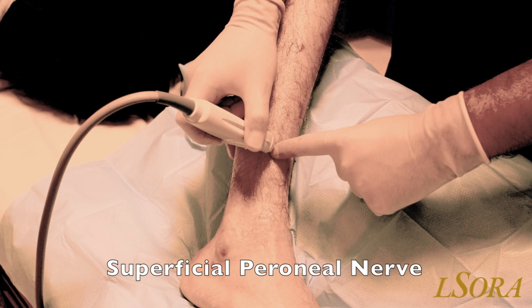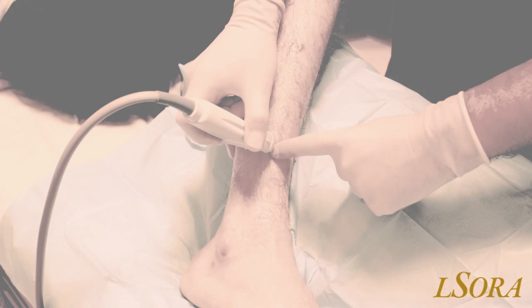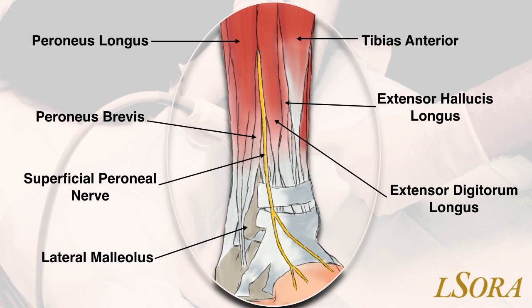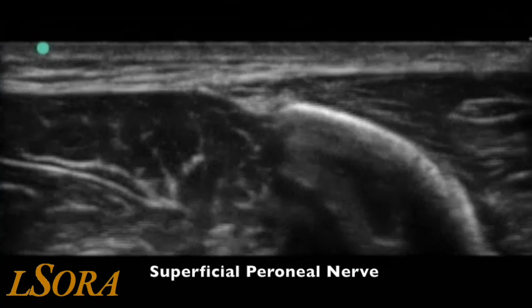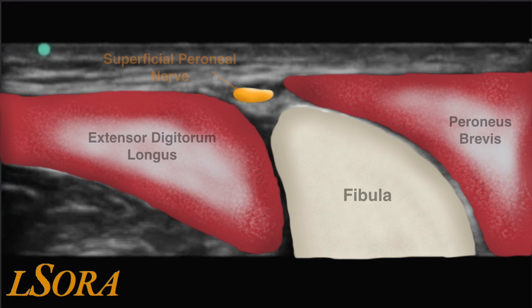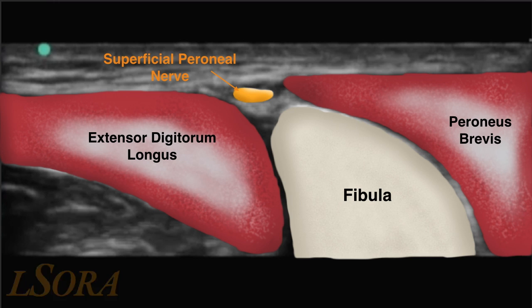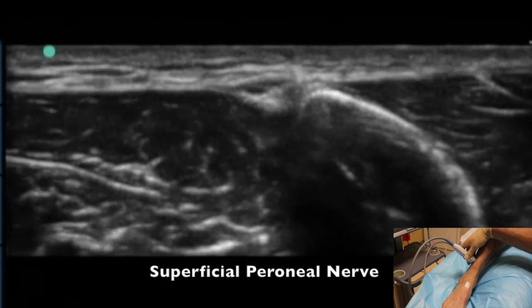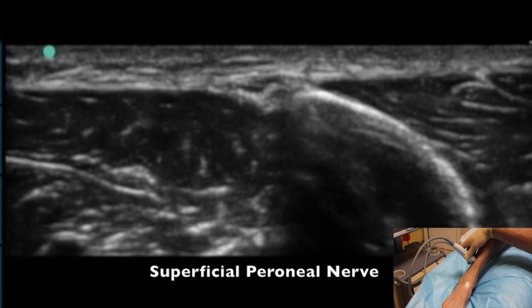We will now cover the superficial peroneal nerve. Examining the anatomy at the lateral aspect of the ankle, you will see the lateral malleolus, and posteriorly the muscles of peroneus longus and brevis, and anteriorly the muscle of extensor digitorum longus. The superficial peroneal nerve passes between those muscles, and as we ascend up the leg, it dives deep between peroneus longus and brevis. The probe is moved to the lateral aspect of the ankle. You will identify the fibula, pointing to a hyperechoic structure sandwiched between extensor digitorum longus and peroneus brevis. The left-hand side of the screen is anterior, the right-hand side is posterior. As the probe is slid up and down the leg, you can follow the superficial peroneal nerve as it travels between the fascias.